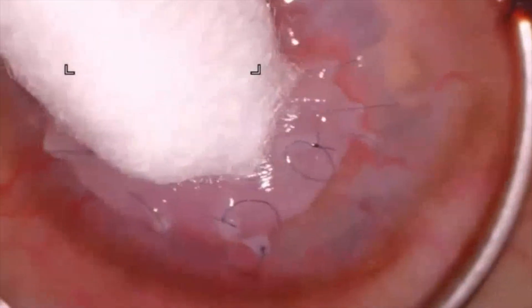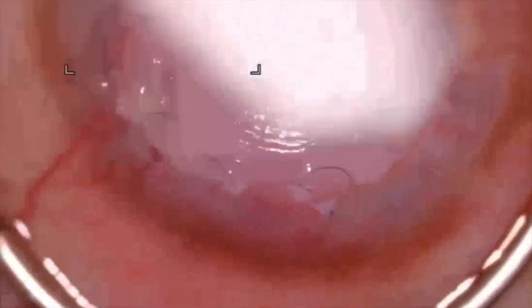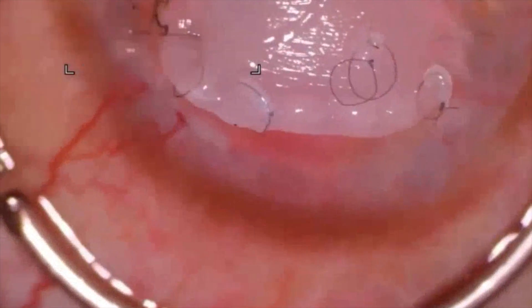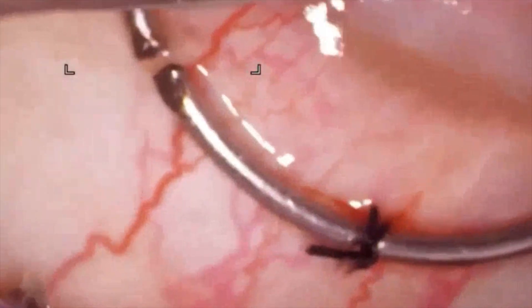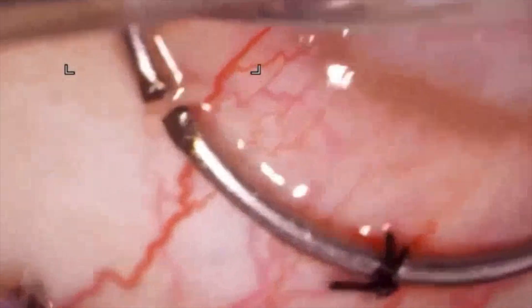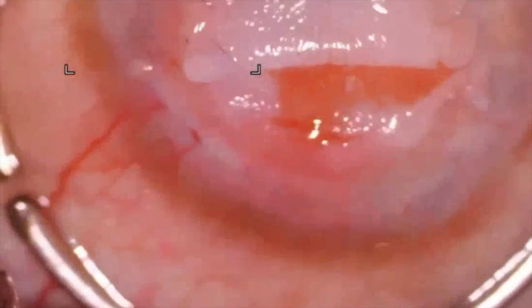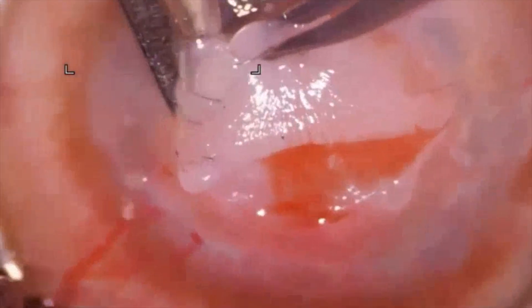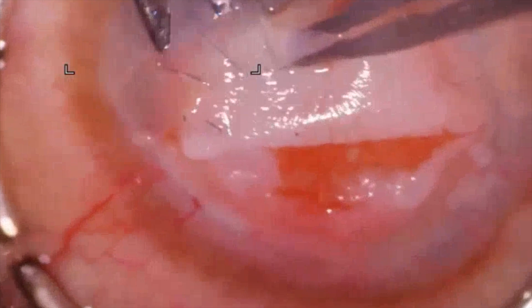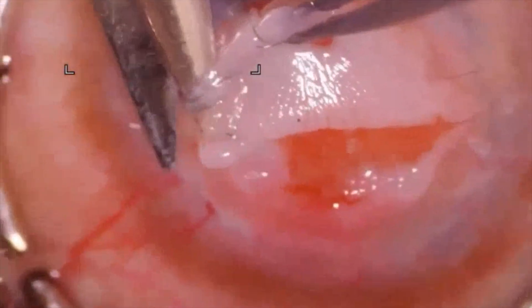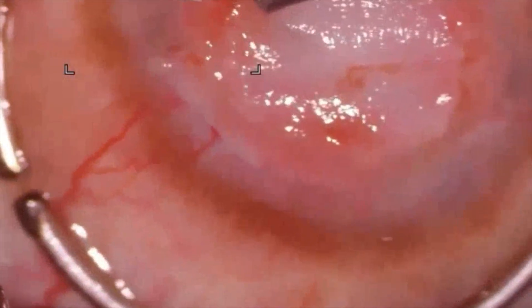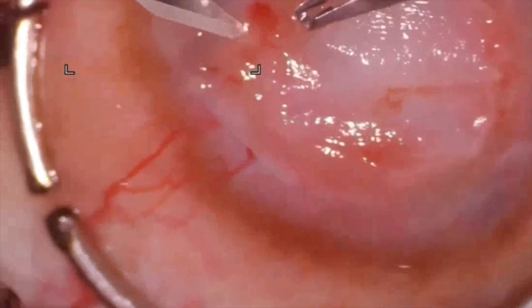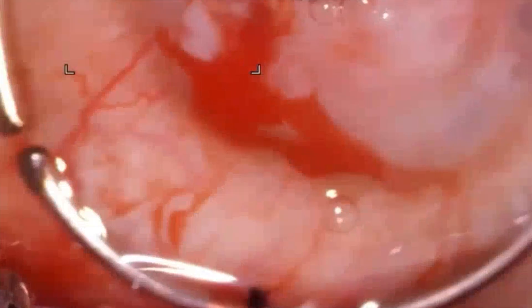The patient was planned for a repeat grafting due to the threat to ocular integrity. Calipers were used to assess the previous graft size. Simultaneous graft preparation was deemed safe as there was no sign of active infection and no indication to cut past the old graft-host junction. A graft-host disparity of 0.5 mm was taken.